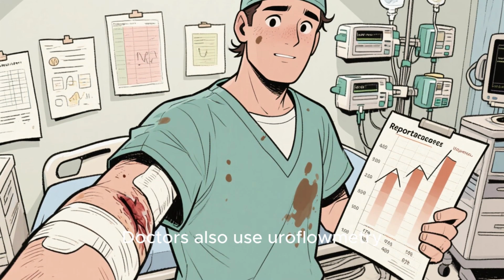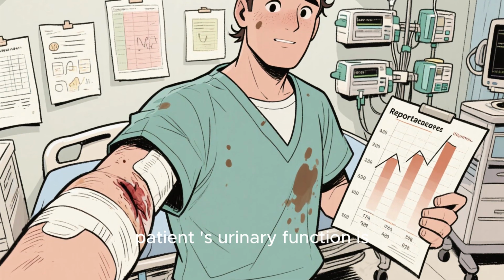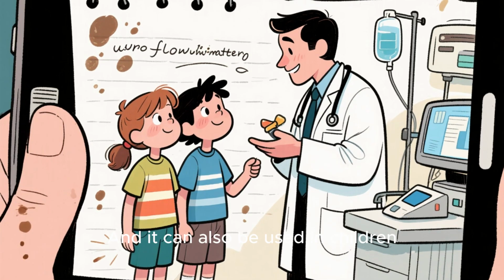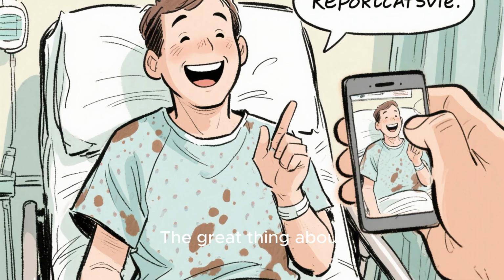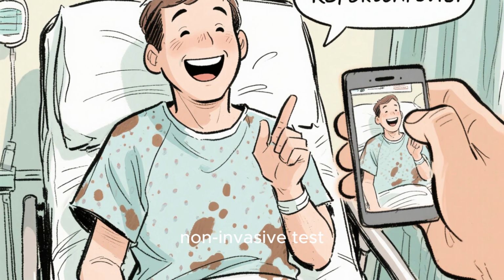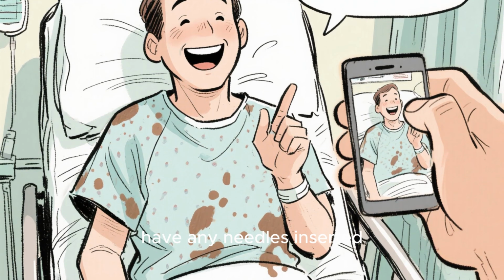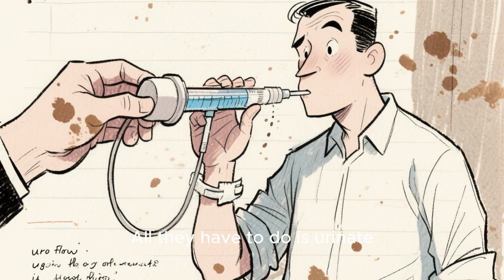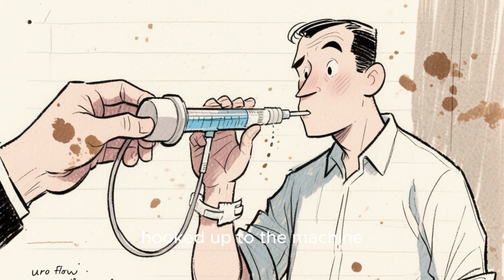Doctors also use uroflowmetry after surgery to monitor how well the patient's urinary function is returning to normal. And it can also be used in children to check for urinary tract dysfunction. The great thing about uroflowmetry is that it's a non-invasive test, meaning that the patient doesn't need to be cut open or have any needles inserted. All they have to do is urinate normally into a container while being hooked up to the machine.